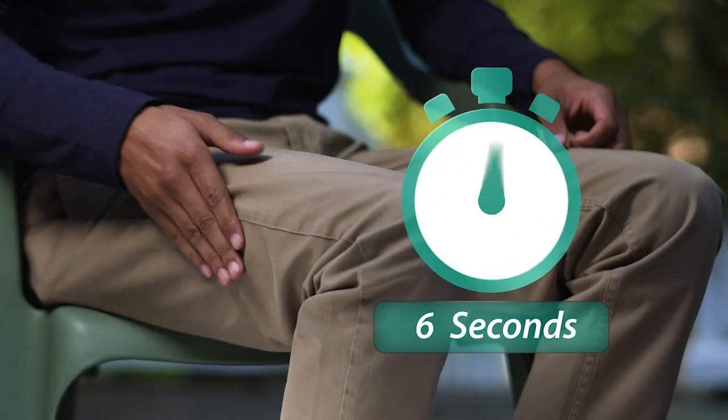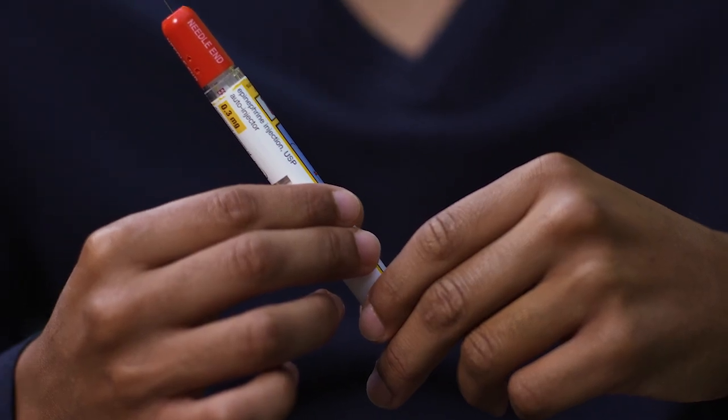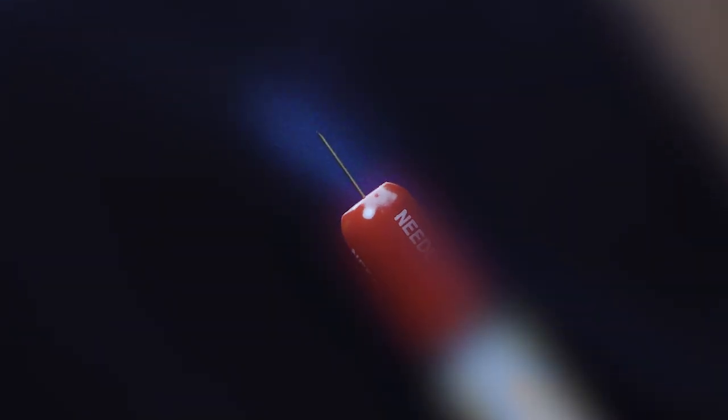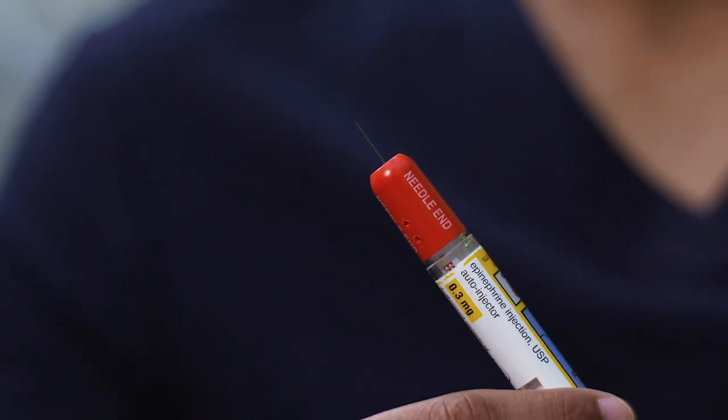Remove the auto-injector from the thigh and massage the injection site for 10 seconds. It is normal for most of the medicine to remain in the auto-injector after the dose is injected. The correct dose has been administered if you see the needle sticking out of the red tip. If you don't see the needle, you did not receive an injection and you need to repeat the injection process. The epinephrine injection USP auto-injector is a single-use device — it cannot be reused.